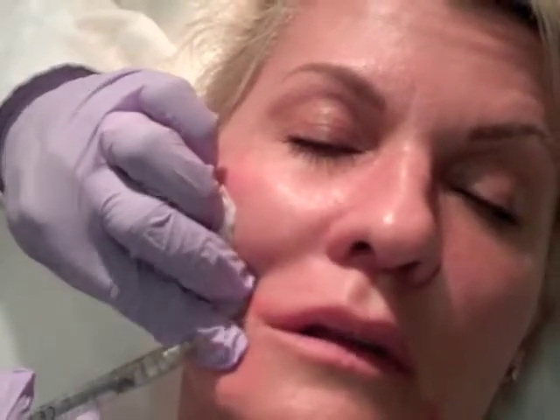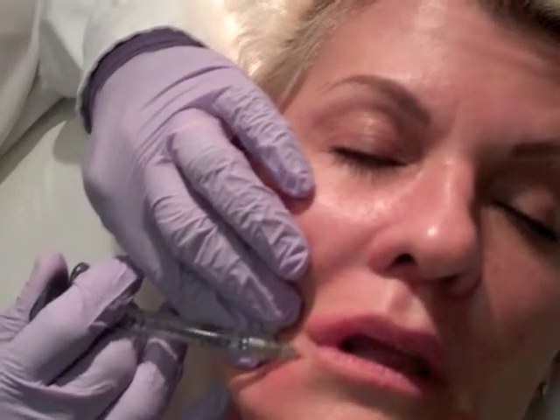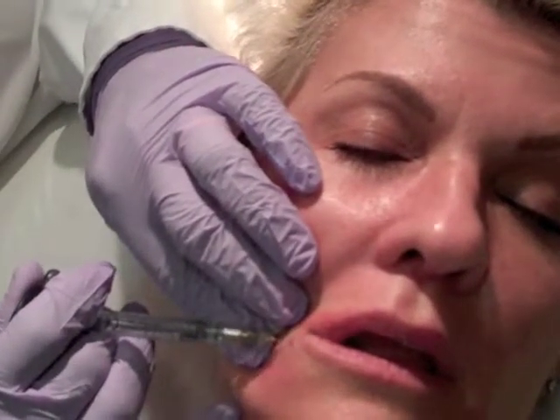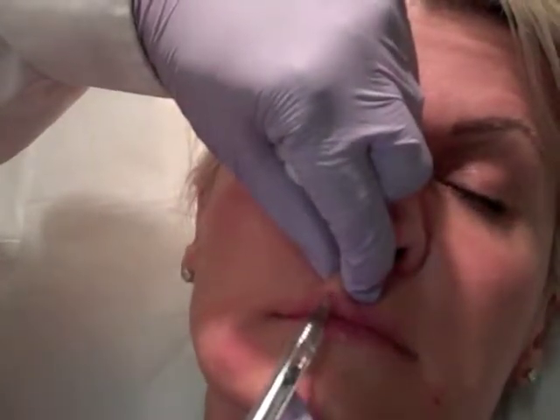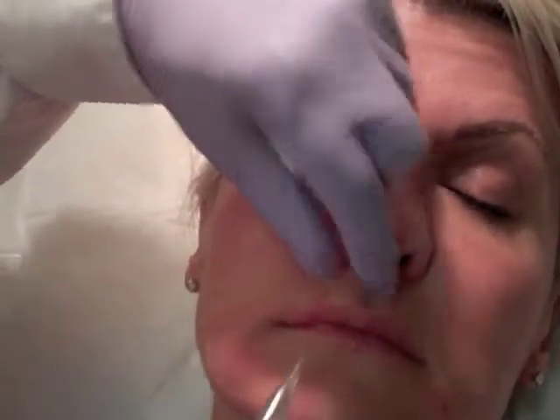Just doing that and then the corner there — there's a K-shape fill of the corner here, just a little bottom lip so we need to maintain a nice angle there with full support on the sides. You can see just a little up here, nicely delineated vermilion border. Then the pillar there — there are many ways of filling this up and I usually grab it, put a small amount of filler, just a very small volume, and you can see it nicely sticks out on there.